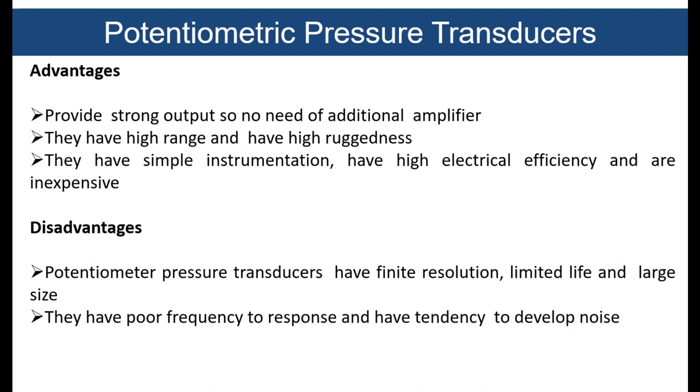Because it is large in size, it is not feasible to use everywhere. They have a poor frequency of response and a tendency to develop noise. Also, we can say that this point is absolutely correct. Their frequency response is such that we have to continuously apply the pressure to understand the concept. You have to apply the pressure to measure that.